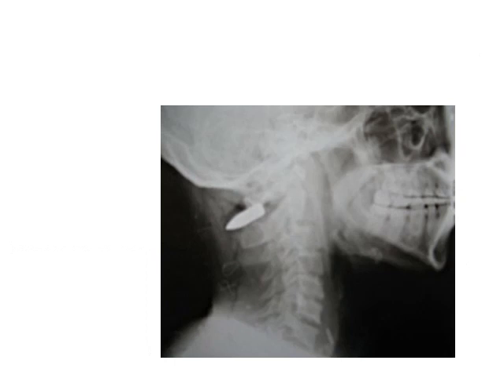This next one is a metal bullet that got lodged right in between two vertebrae. This person's spinal cord was not hit and they were not paralyzed. Metals come up as a nice distinct white compared to bone — you can see the bones here are kind of grayish, and the metal is white. Metals also often have a kind of non-natural, very distinct form to them on the x-ray.